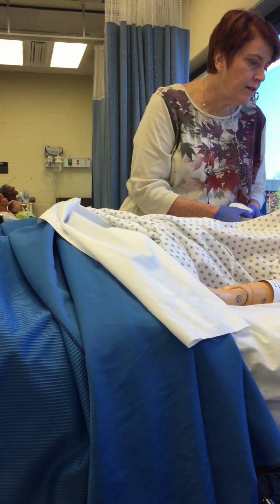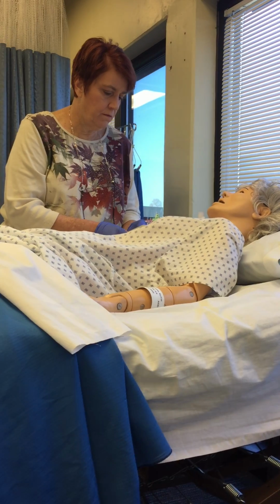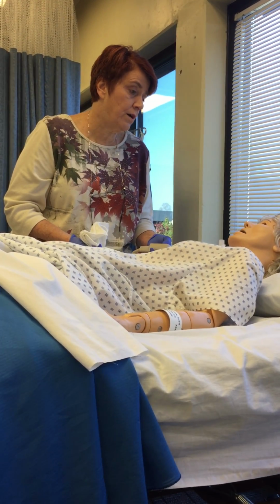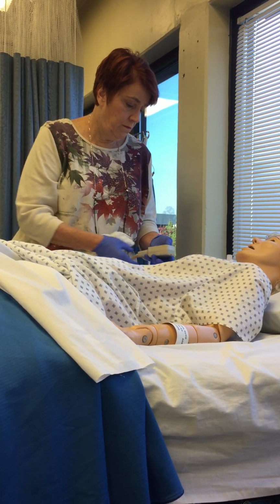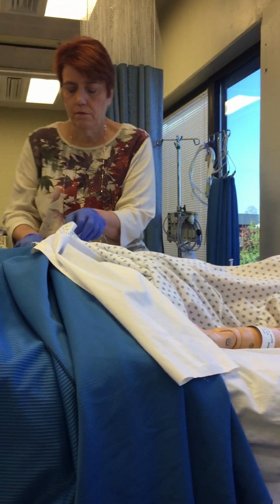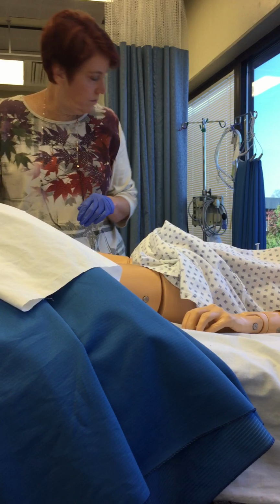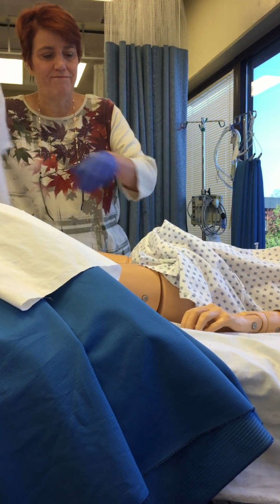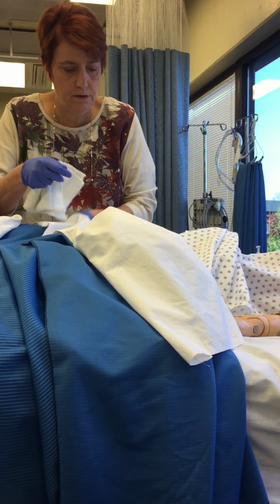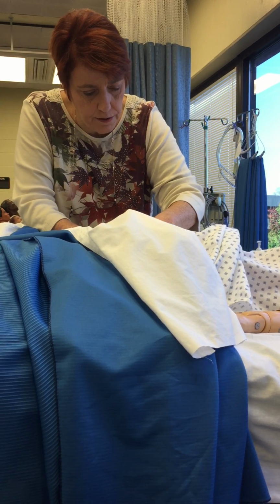Have you been having any trouble voiding or peeing? Having trouble getting to the bathroom in time? Well, this will help that as well. We'll keep you covered as much as I possibly can. And we're going to just wash down here.